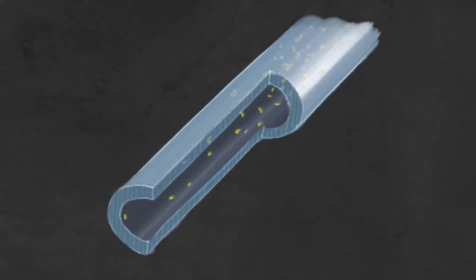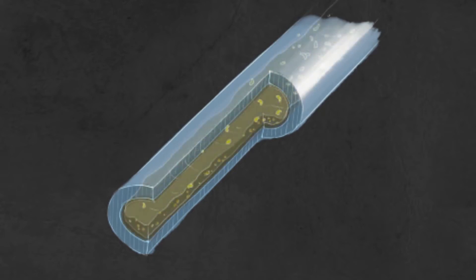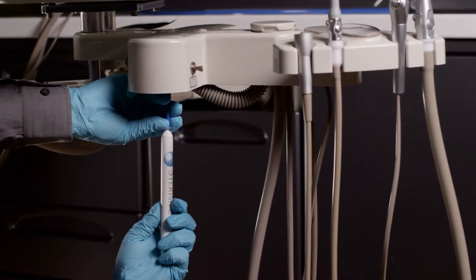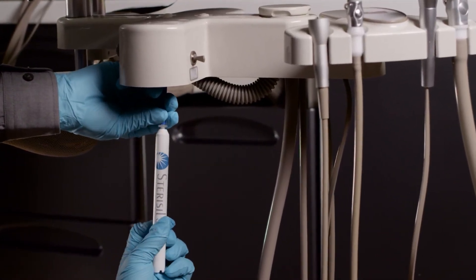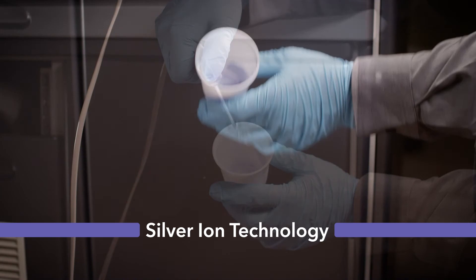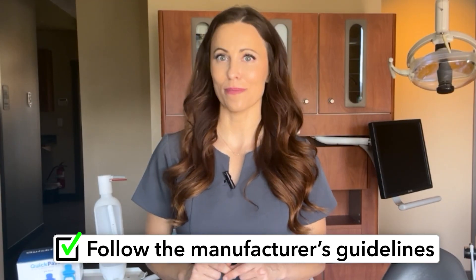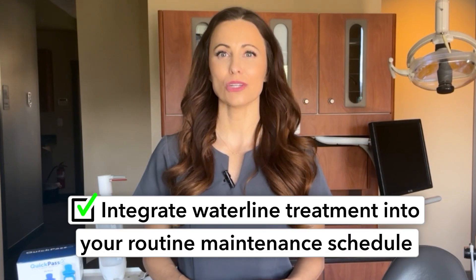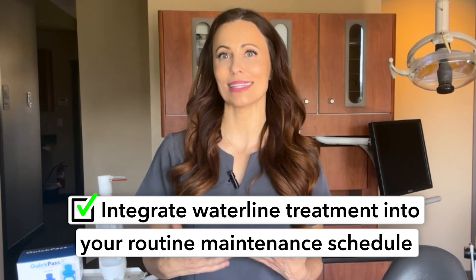Even with regular flushing, water line treatment using a low-level chemical like silver or iodine is necessary to prevent the formation of biofilm, which can harbor harmful bacteria. Using products like the Stericil straw from Solmedix, which is designed specifically for dental water lines, helps to create safe water during dental appointments through silver ion technology. It is important to follow the manufacturer's guidelines closely and to integrate water line treatment into your routine maintenance schedule.